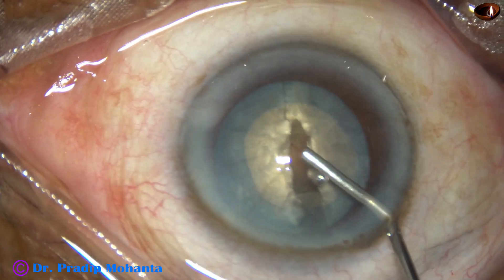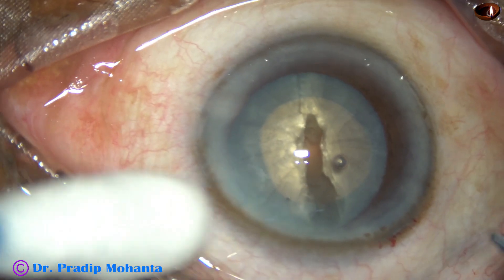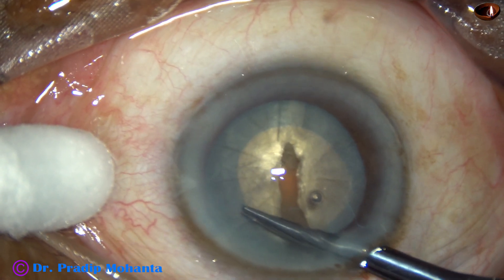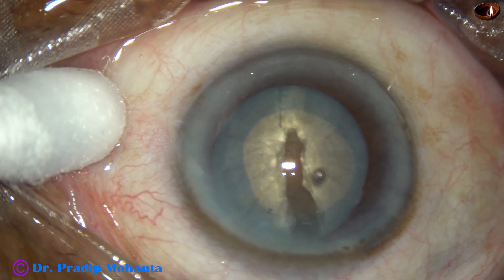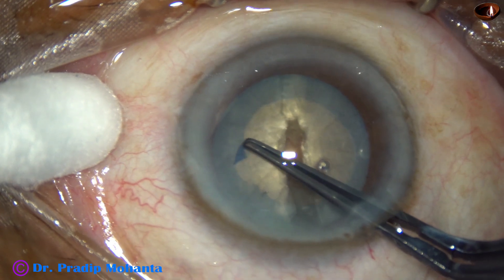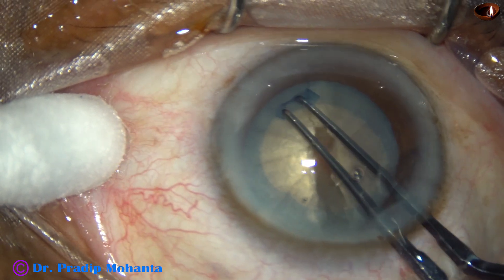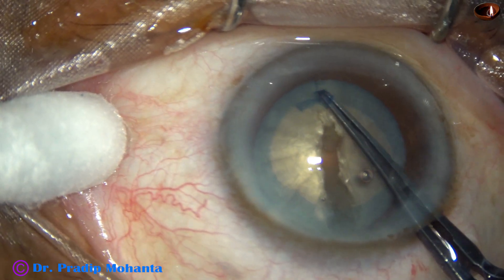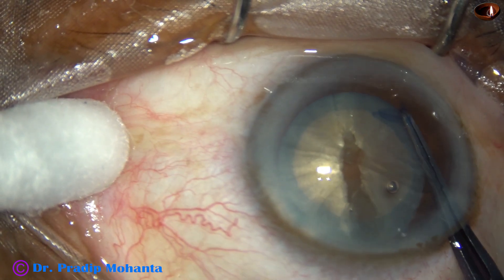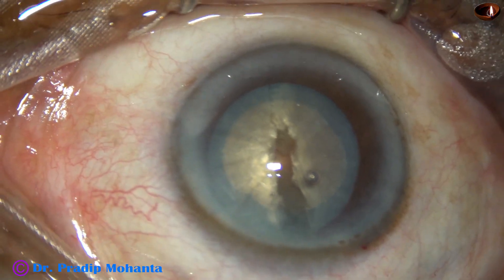So I decide to enlarge the rhexis. The rhexis rim is thicker from 12 o'clock to 3 o'clock, so I make a cut at around 1-2 o'clock and go clockwise. I should have made it a little larger, but I hope this size of the rhexis will help manage this case.